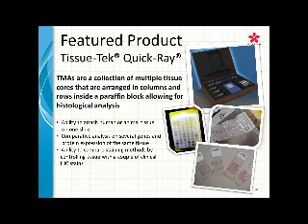And remember that all of your reagents for immunohistochemistry kind of keep a stable pH. And so using DI water, you can determine that you have a consistent pH, so that that's not going to interfere with the reaction between the antigen and antibody. So it's very, very important to use DI water. That's probably one of the most important places to use DI water in immunohistochemistry, along with making your bulk reagents.